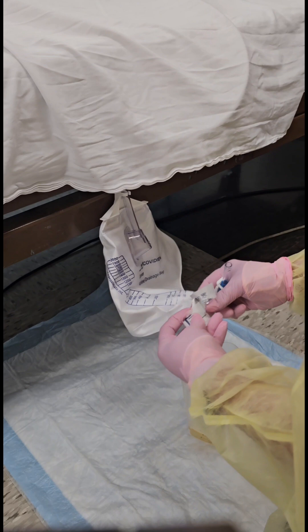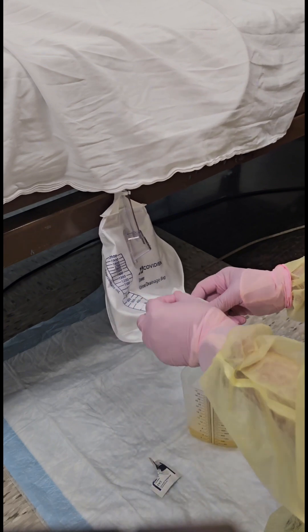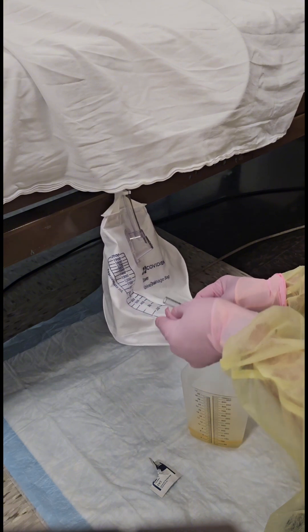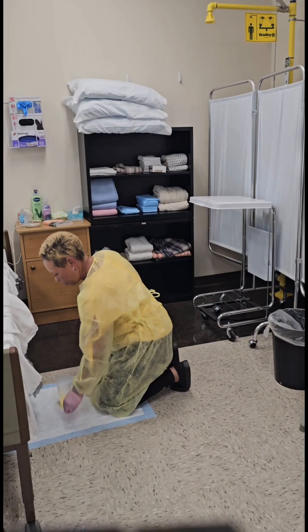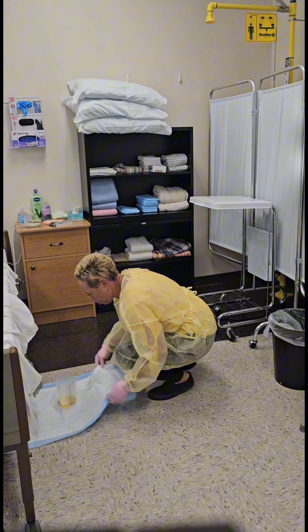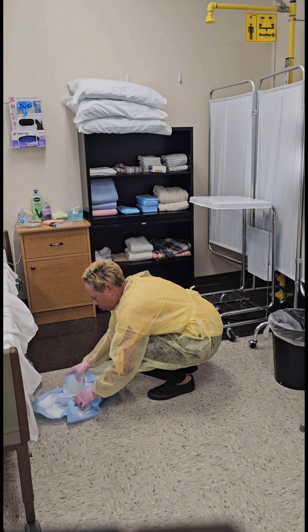Clean the edge of the drainage tube using an alcohol wipe. After cleaning the edge of the tube, replace it back into the holster. Dispose of trash into the waste bin, then gather the graduate inside of the clean barrier.